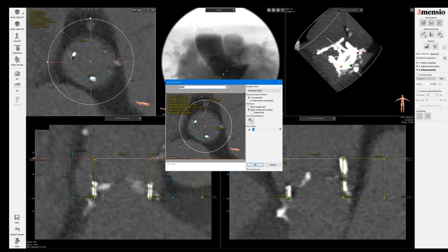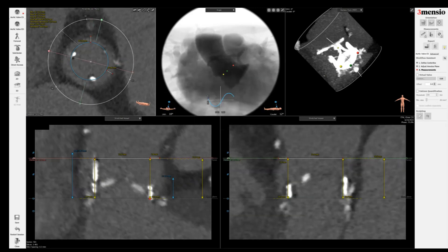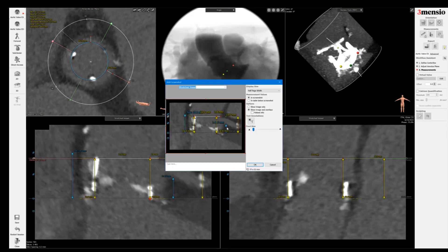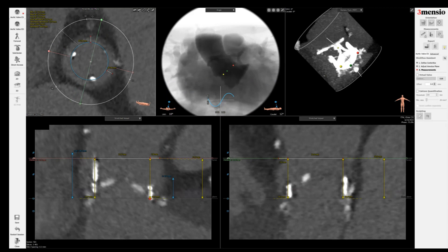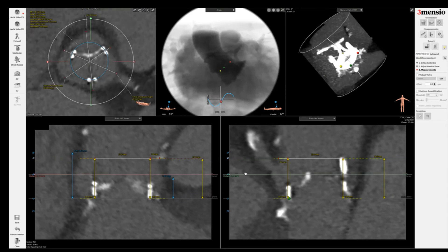I'm labeling this as VT-STJ left main CA. I'm going to continue the rest of my workup. This is the left main view showing the 3.8 that I was showing earlier. Based on the VIVID data, anything less than four millimeters for this distance is considered moderate or high risk for coronary obstruction. But you can see that here it should be pretty safe.